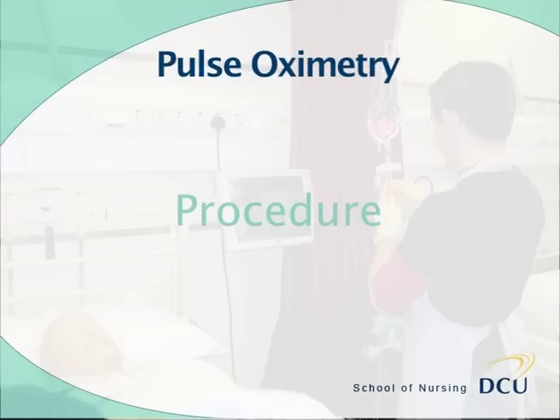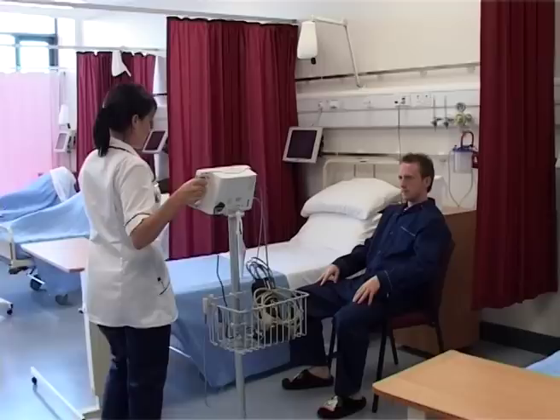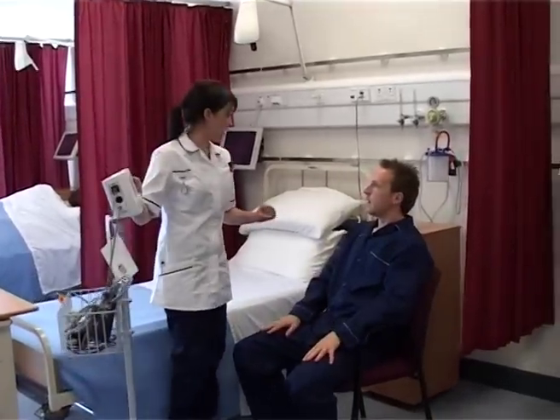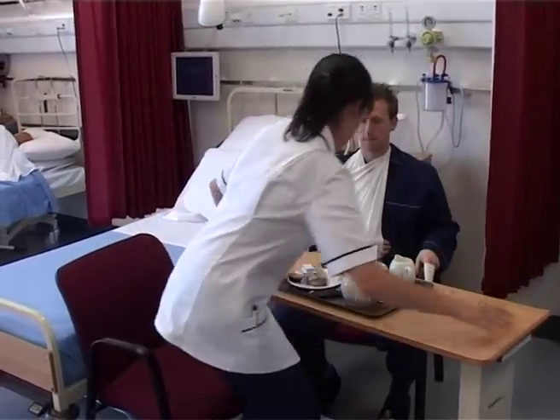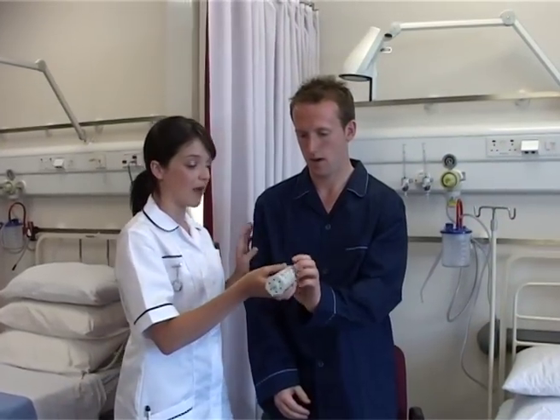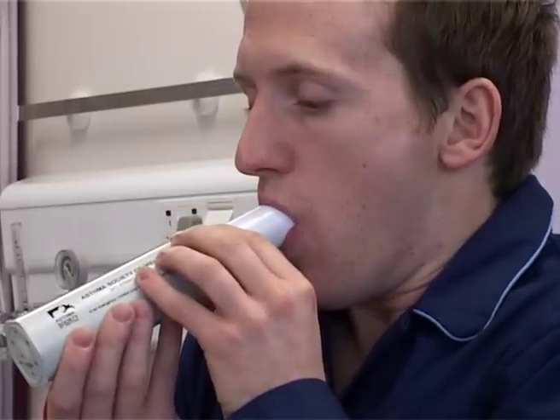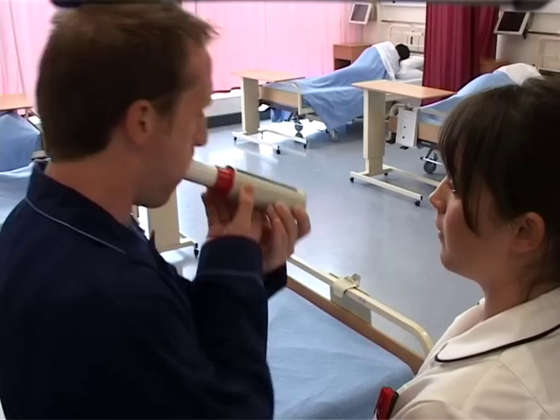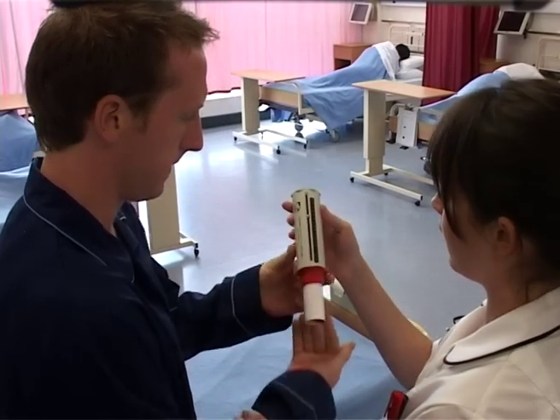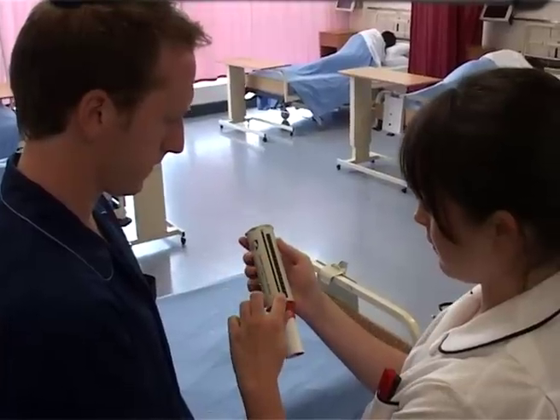Procedure: Instruct the patient to inhale deeply, place their lips firmly around the mouthpiece creating a tight seal, and then exhale forcibly, as hard and fast as possible. Note the measurement and reset the peak flow to zero before the next reading.